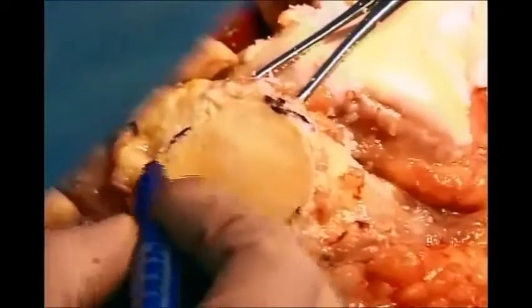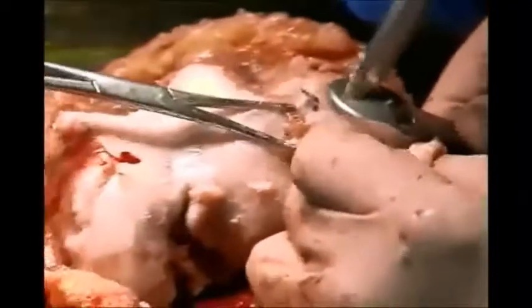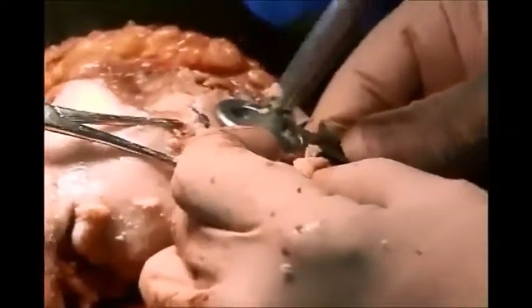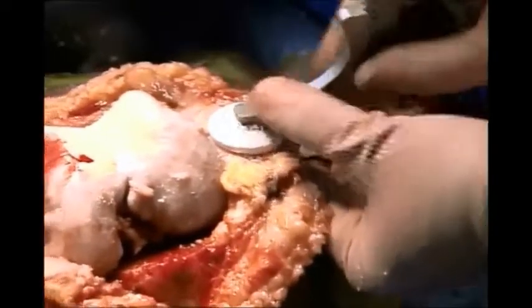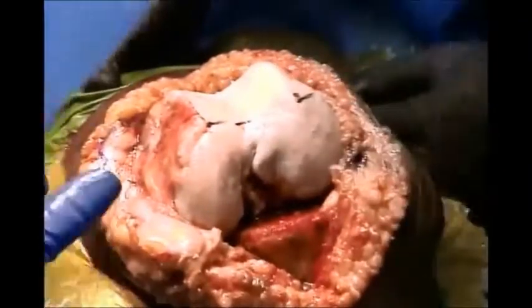Identify the boundaries of the patella and draw a vertical line which is the median ridge. The two holes of the anatomic patella should lie on that line or ridge. Then you place a trial component and measure the overall construct — it should be equal to what you started with.